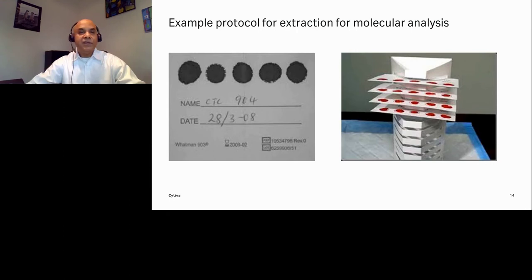The majority of the diagnostic techniques, for example, particle agglutination tests and enzyme immunoassays, which have been used to screen for antibodies in DBS, are simple and generally require little capital expenditure. The use of the agglutination test is particularly cost-effective as it can be performed in the absence of an electricity supply. This is ideally suited to countries with limited health budgets.